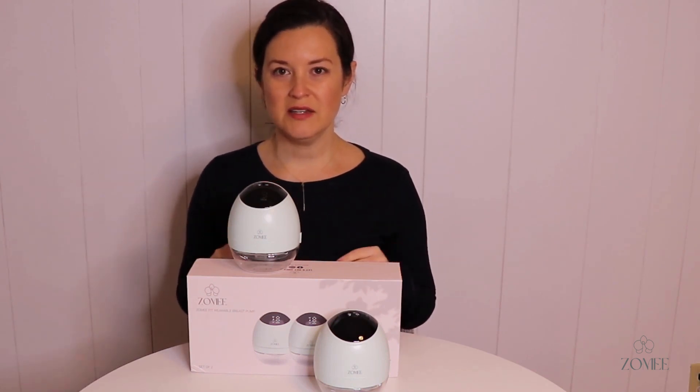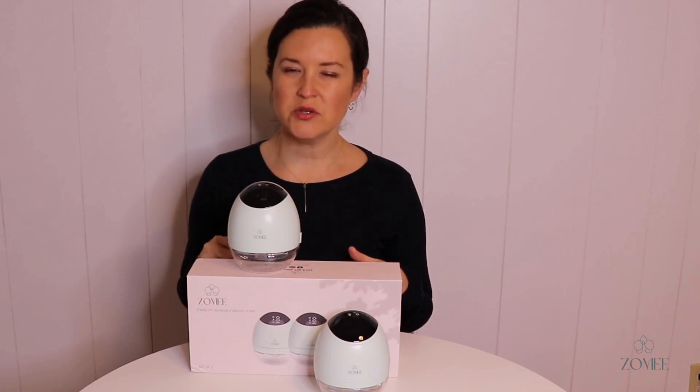The pump also has quick charging using the cords that come with it — if you charge it for just 10 minutes, you should get about 30 minutes of pumping out of it. As always, you can ask any questions you have about the pump in the Facebook group.